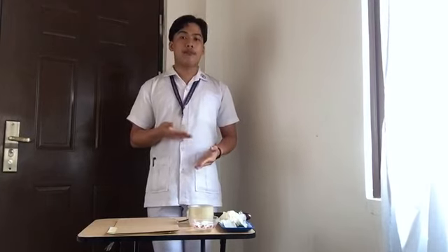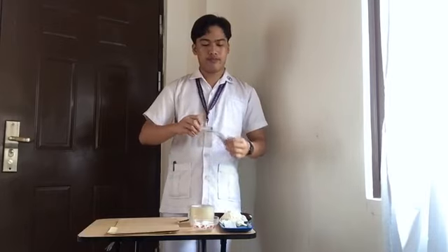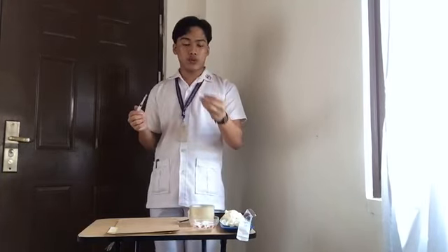Next is withdraw the medication. So first is place the ampule on a flat surface. So I already put the ampule on a flat surface. Next is attach the filter needle to the syringe. So first I am going to open the syringe and attach the filter needle. So I am going to discard this.